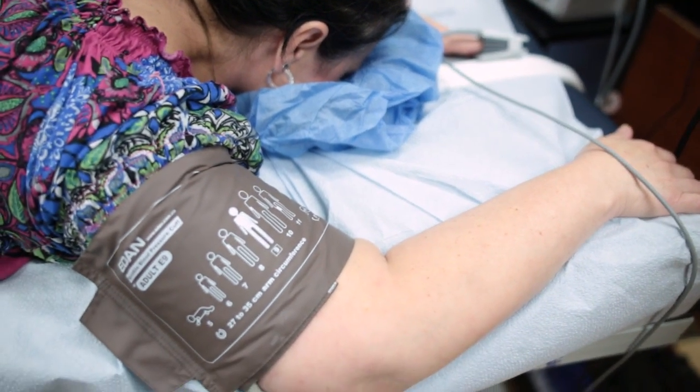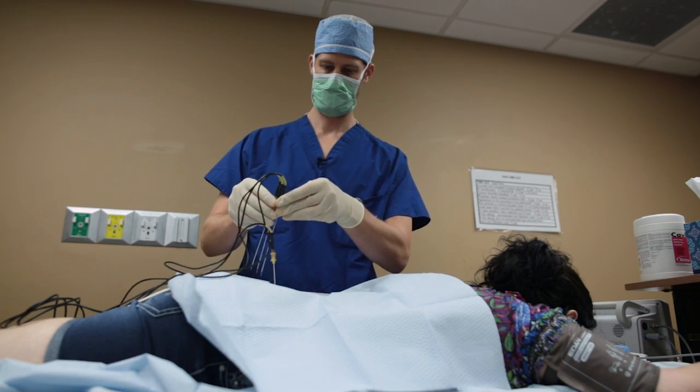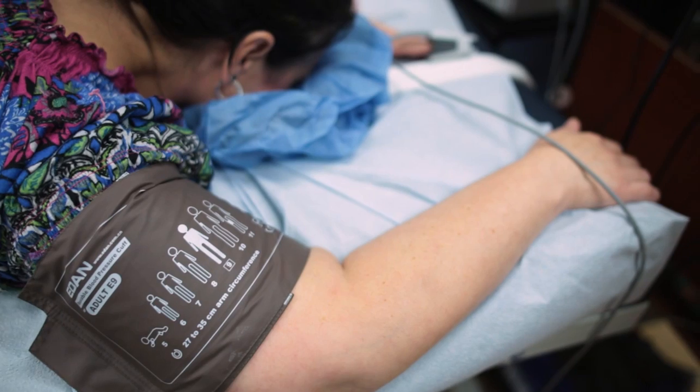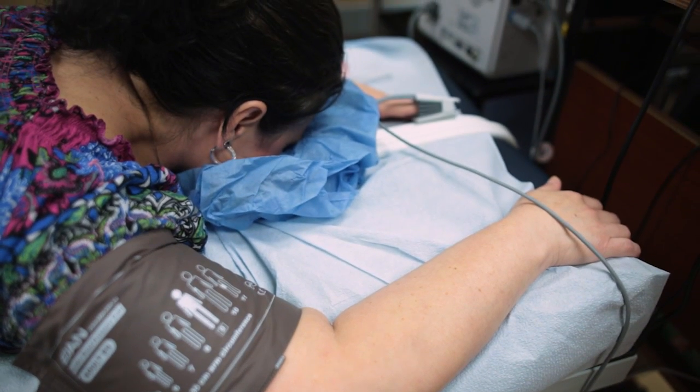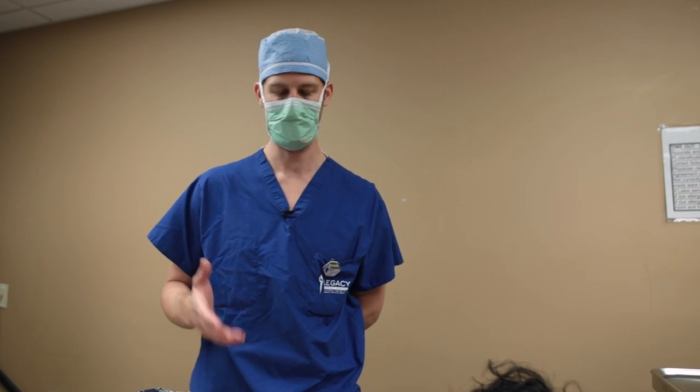At the end of the procedure we're going to remove the needles. After your procedure you may have some soreness in your back, which is normal for a few days, and hopefully this will give you long lasting relief to your back or neck pain. This is a one-sided procedure, so if you still have pain on the other side and get good relief from the side that you had the procedure on, we can proceed to the next side as well.